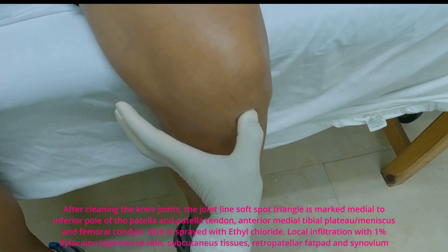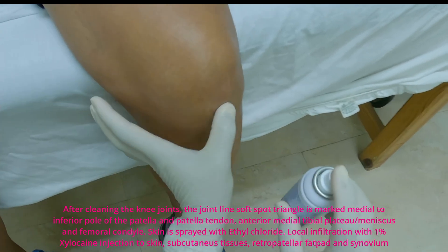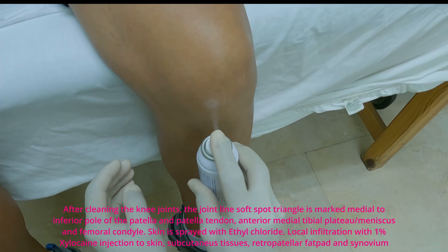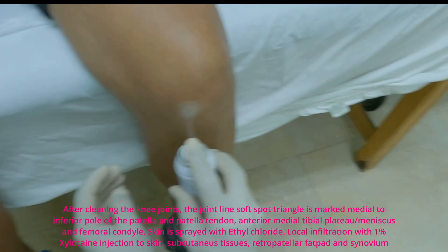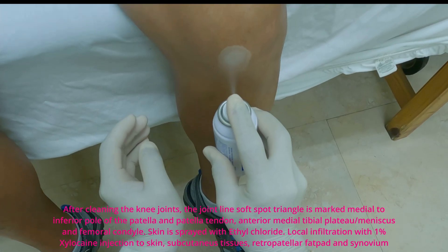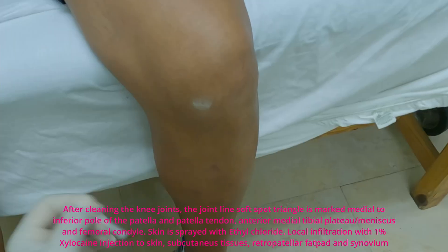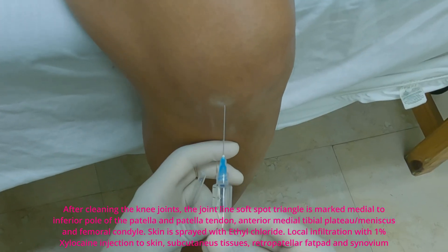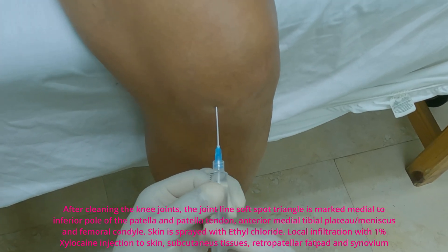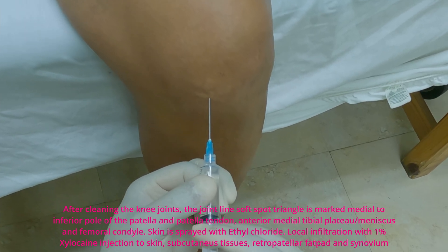After cleaning the knee joints, the joint line soft spot triangle is marked medial to the inferior fold of the patella and patellar tendon, anteromedial tibial plateau slash meniscus, and medial femoral condyle. Skin is sprayed with ethyl chloride, followed by local infiltration with 1% xylocaine injection to skin, subcutaneous tissues, retropatellar fat pad, and synovium.